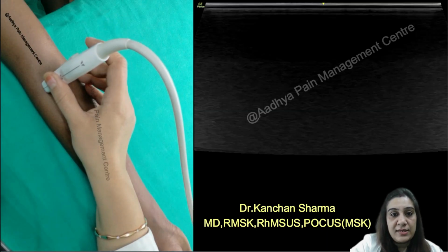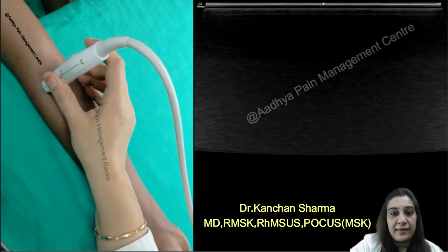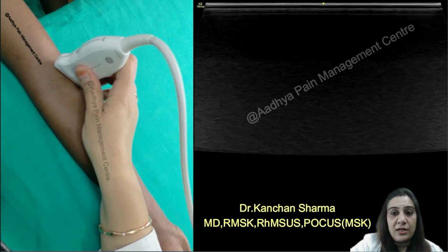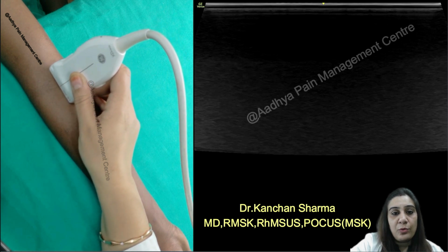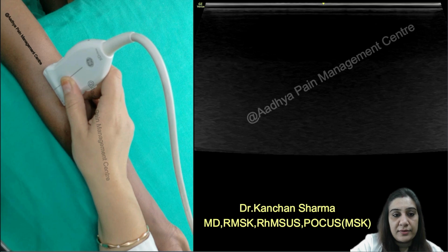To visualize this, we maintain the home page view. And then we slide the probe medially towards the trochlea. Centering the trochlea on the screen, we will rotate our probe to 90 degrees and we will be able to identify the humero-ulnar joint. Now, keeping the same craniocaudal orientation, we then slide the probe laterally to evaluate the radiocapitular joint.